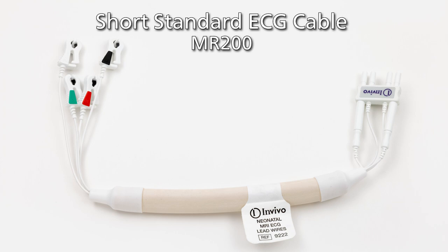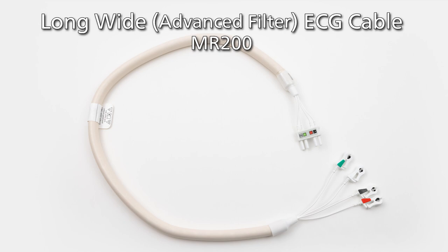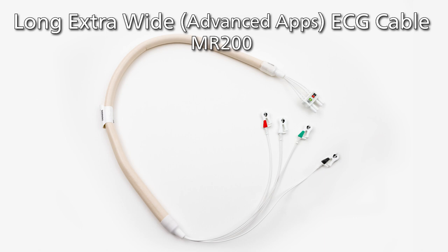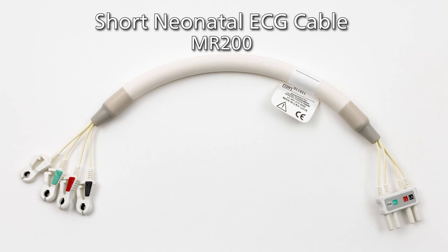Short standard, short wide, also known as CV, short neonatal, long wide, also known as advanced filter, and long extra wide, also known as advanced apps, that pair with the three different electrodes: single patch or standard ECG electrodes, multiple patch or CV ECG electrodes, or neonatal ECG electrodes. For this training, we will focus on the three most versatile and commonly used cables: the long wide ECG cable, the long extra wide ECG cable, and the short neonatal ECG cable.